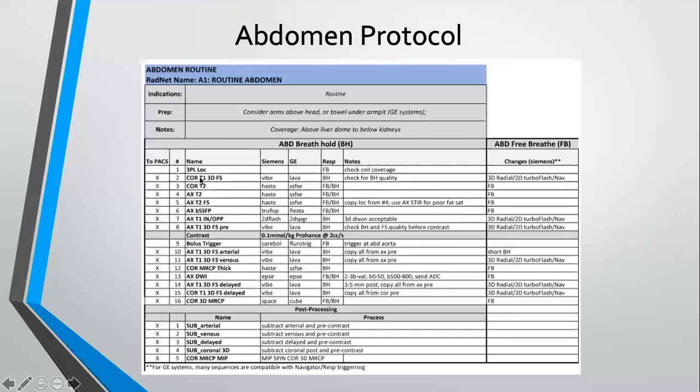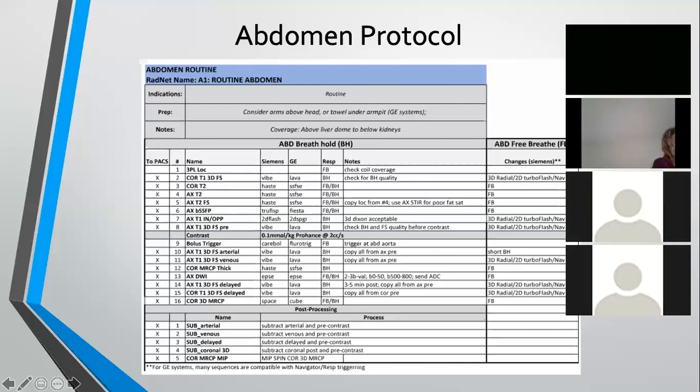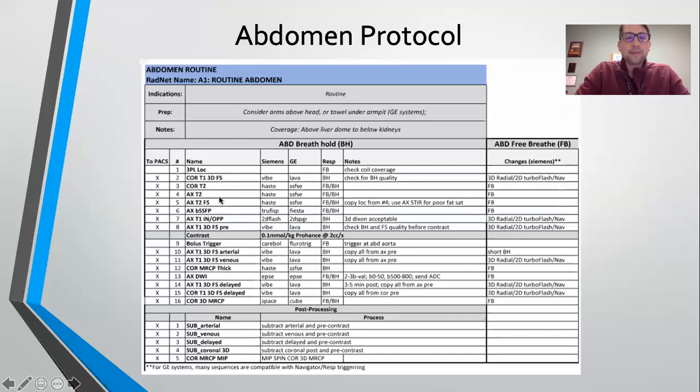You had them hold their breath that first sequence, give them a break, and then we'll hit them with a couple more breath holds right before we inject contrast. So Dina down at Winship is great about that. She kind of changes her sequences to make it more comfortable for the patient. So just take note of why these technologists are doing the things that they do. I just thought that was a great idea that she does that.